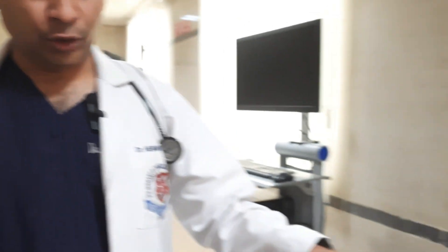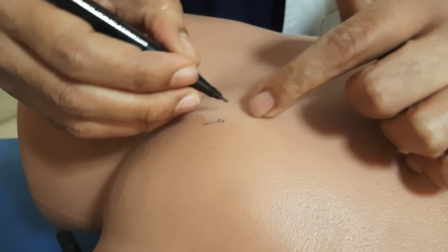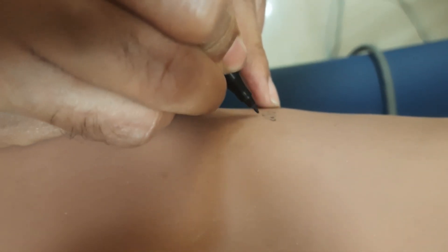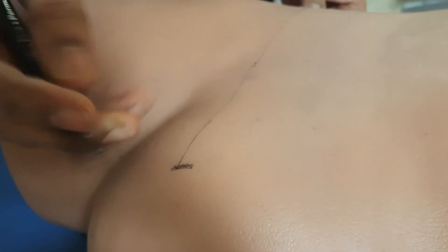Before going to the procedure, first we will see the surface anatomy of femoral vein and we will mark the site for insertion. We will take two points: one point is at the pubic symphysis where the two bones join, and another point is the prominent part in the groin area, that is the anterior superior iliac spine.